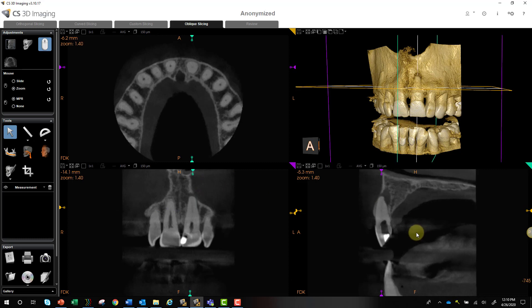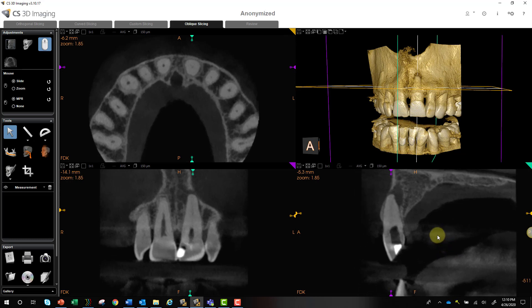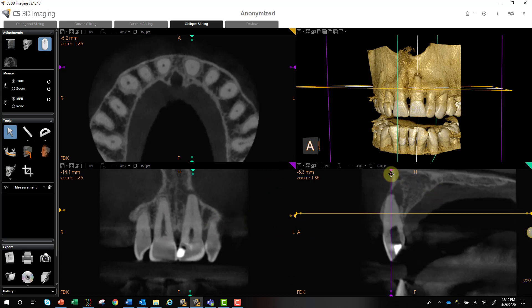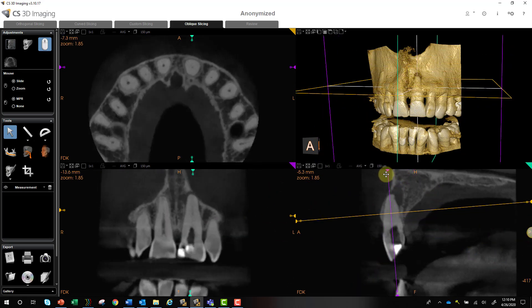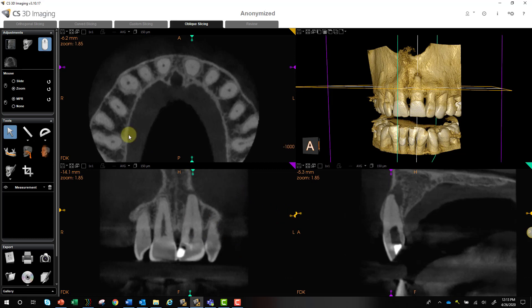I can change to zoom and zoom in a little bit further too. The same goes for our coronal slice — if I look at my purple coronal view, if this were not associated with the long axis, I can change that in order to see things very clearly in this view. By the way, you'll notice I'm going back and forth between slide and zoom very easily just by selecting Control A. Shout out to Veronica, one of our trainers, for that little tip.